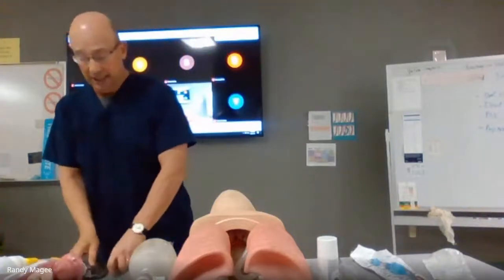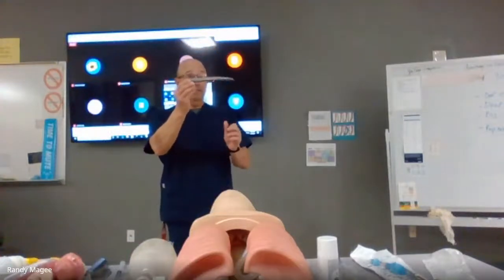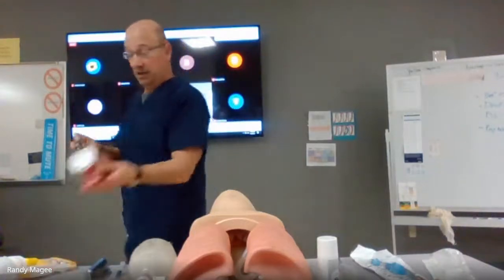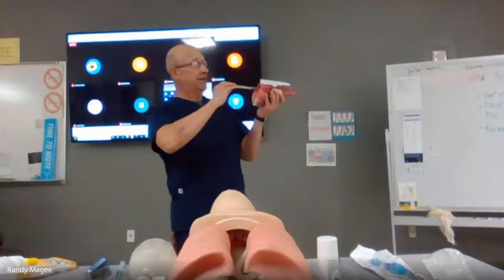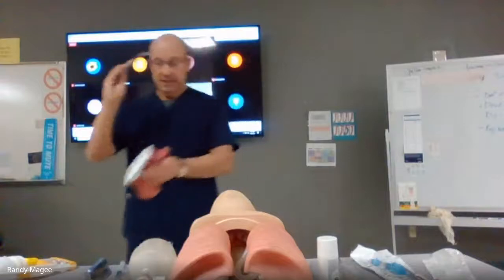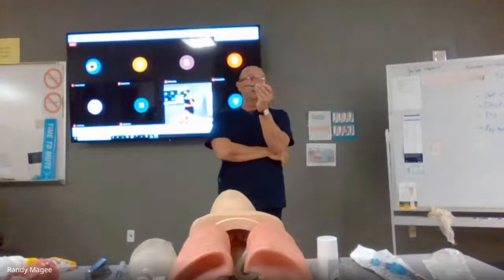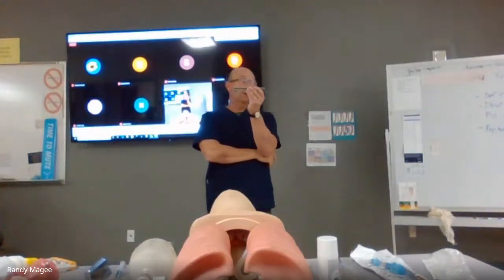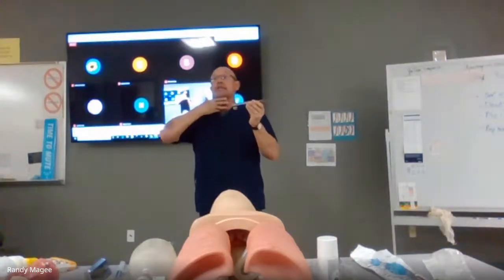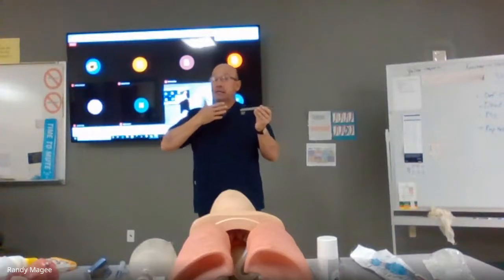The other blade that you have, both with this and a glidoscope, if you have a straight blade or a Miller blade, now the Miller blade directly lifts the epiglottis. So you go down there and you find the epiglottis, and the Miller blade directly lifts the epiglottis. Now there's a distinct purpose for the Miller on fatties, people with no neck. Most of the time, those patients have their vocal cords anterior. They're real anterior, so they're up here. Okay, so they're hard to intubate.